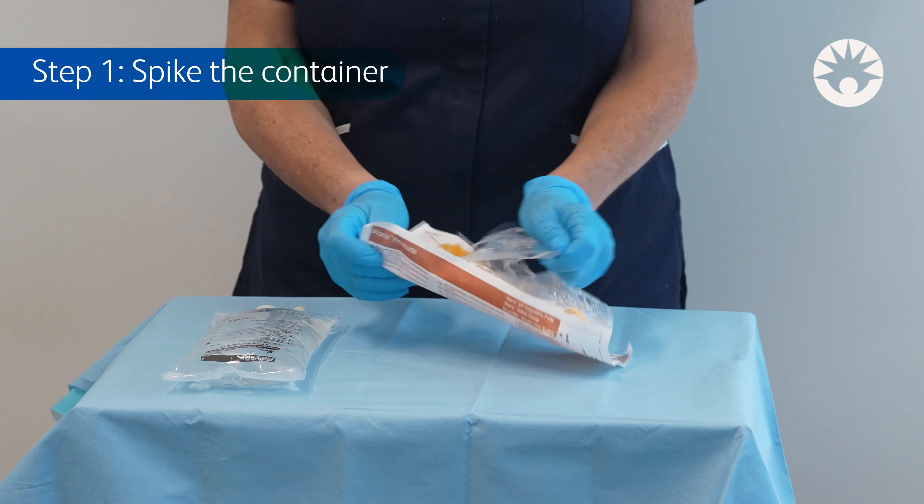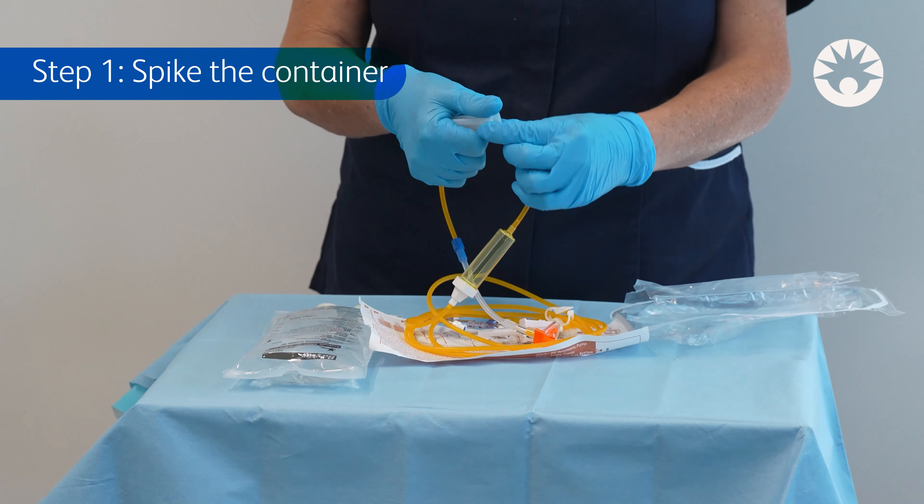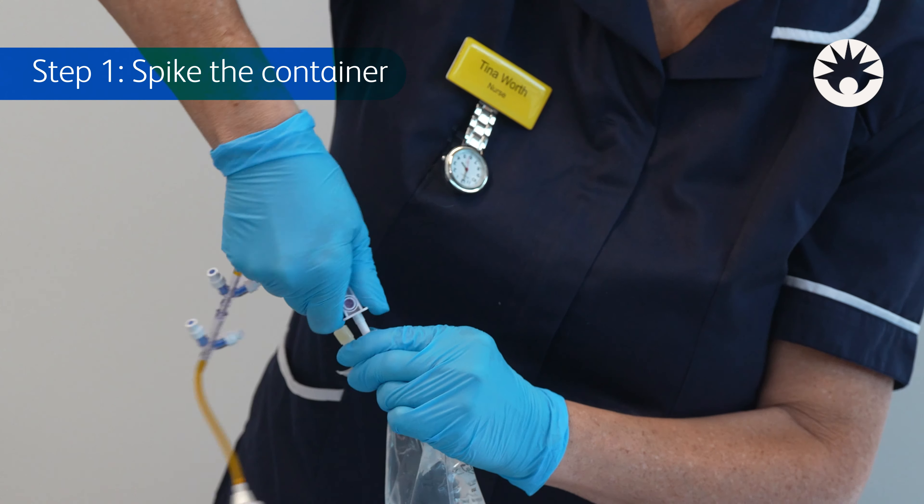Step 1: Spike the container. Start by closing the pinch and roller clamps. Insert the spike into the saline bag.